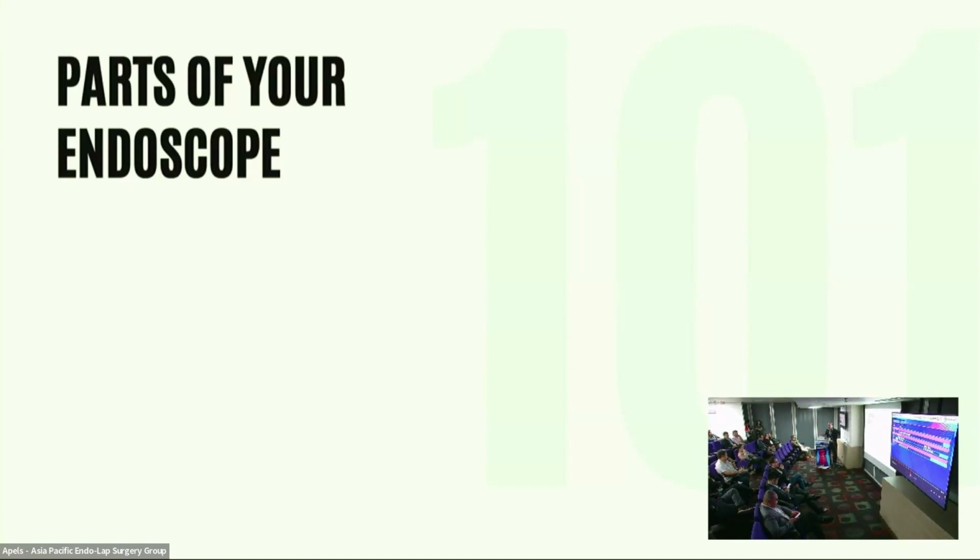So in the country, we have 100 series scopes. In different countries, it would be a 200 series scope. So you cannot interchange those systems. Japan and Europe have 200. North America and us have 100. 100 also in Hong Kong. So you cannot buy a machine from Europe, a very cheap one, and then get a 100 series. They won't read each other. It's like the old TV NTSC and the PAL-SECAM system. They won't match.